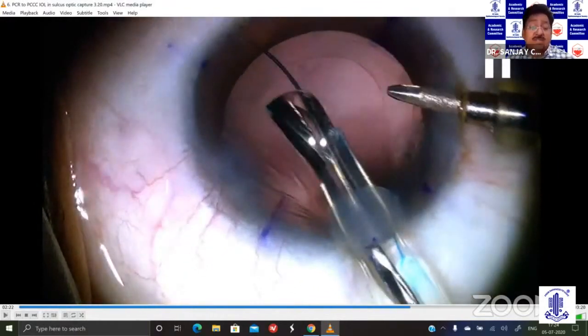And if you notice, when I'm putting this implant in the eye, I want the chamber to be a little harder, because just 24 millimeters of mercury is not a hard enough eye for my maneuverability within the eye. So I raise the bottle height from 30 to 40 centimeters. The eye becomes a little firmer and I can put the IOL in the eye.